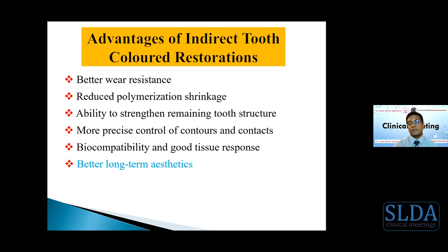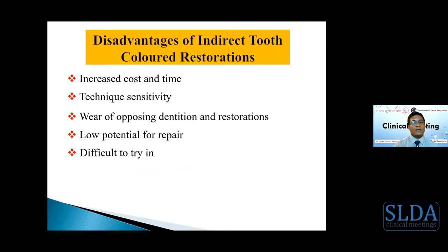There are a few disadvantages as well. They are expensive and time-consuming. They are both operator and technique sensitive. They cause wear of the opposing dentition and restoration from the opposing arch, repairs are difficult with them, and durability is questionable. So repair is not a good long-term solution, and they are difficult to try in, and high skill is required to hold and seat them on the tooth preparation, and fine adjustments are possible only after the cementation.